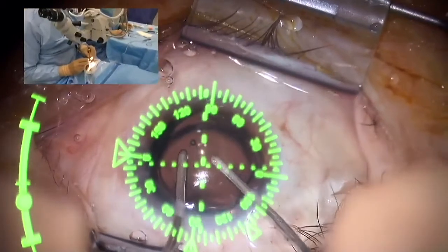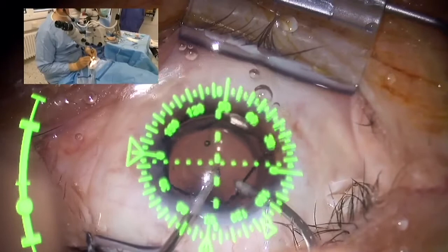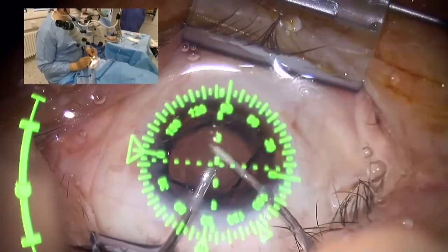And it's also important to remove the viscoelastic between both lenses.